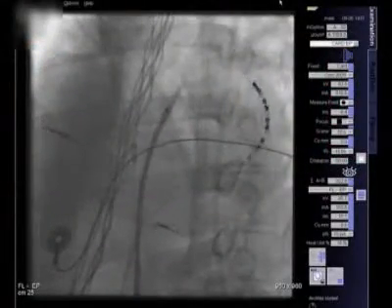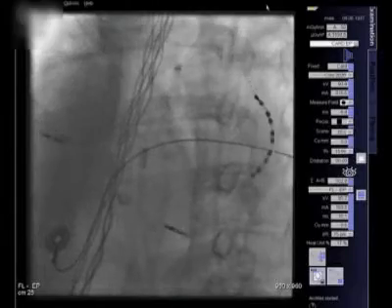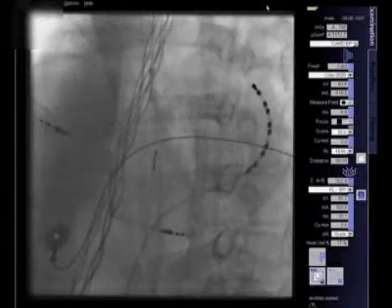Yeah, certainly these procedures are operator dependent. There's a lot of technology, as you see. There's a lot of experience with that technology that the more procedures you do, the overall better your chances of success. Let's take a look here again, the fluoroscopy.